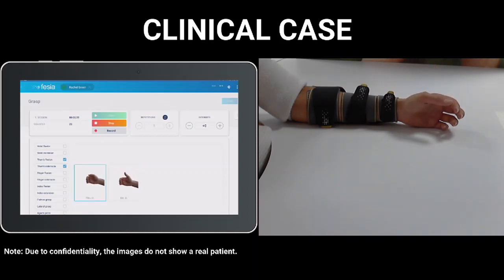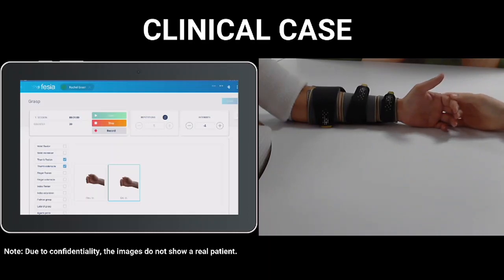Previously, it was said that it was not functional to treat selective movements, but last studies have shown that it is very, very useful to combine both selective and functional movements. And we do the same now as in the previous exercise. I will start decreasing the intensity, and I want you, Rachel, to try to help a little bit the movement. Okay. Perfect. I try to touch her tendons so that I ensure that there is not being any contraction in the other fingers.